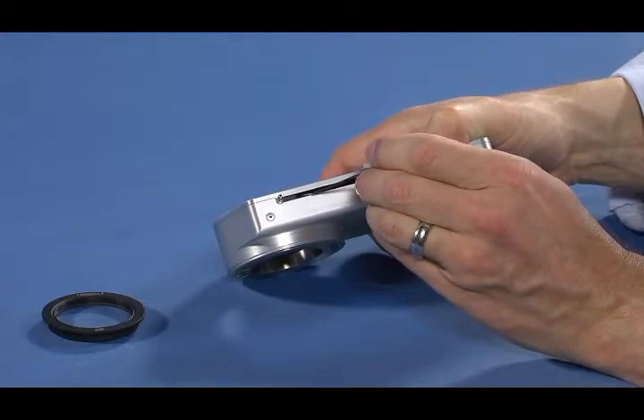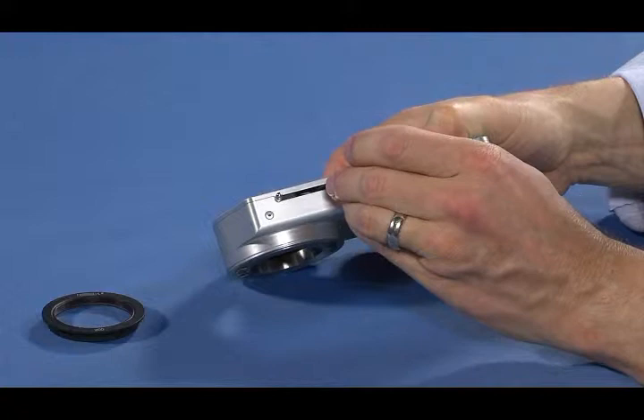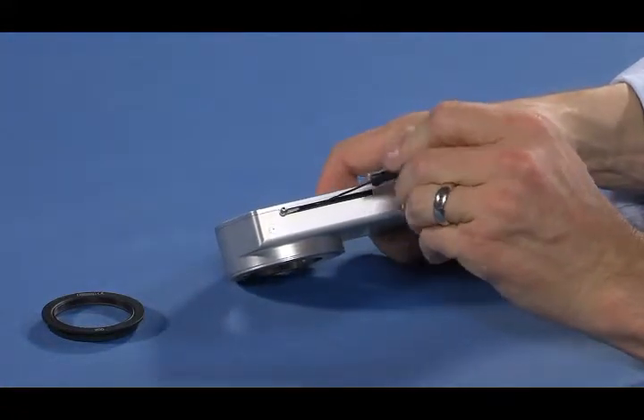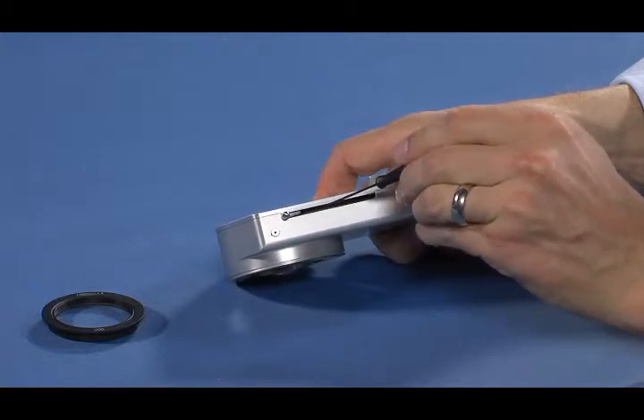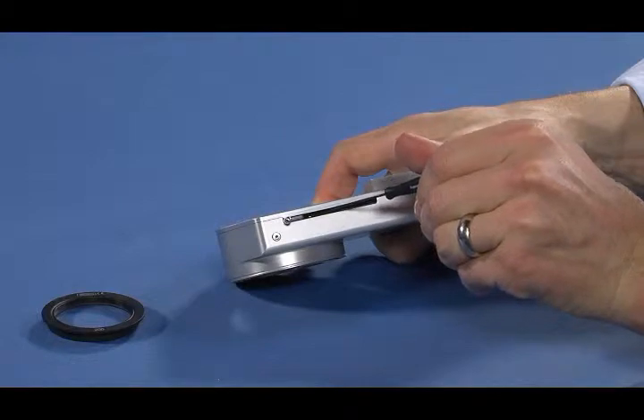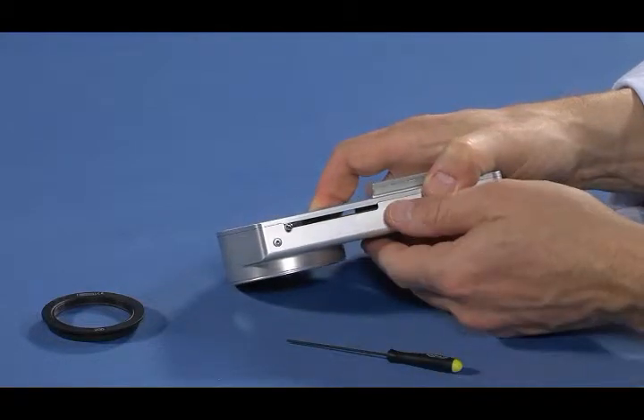Insert the hex wrench from the right side through the handle slot. Loosen the set screw slowly using half turns of the wrench to unsecure the lens. Do not turn the set screw too far as it may become dislodged and fall into the housing.